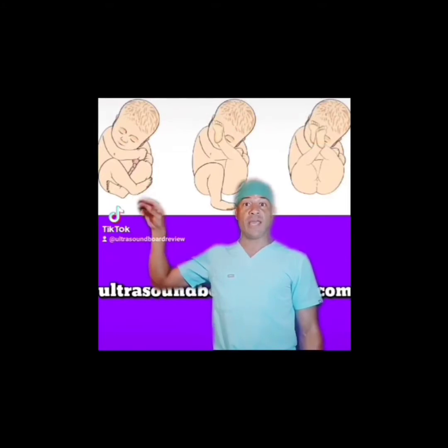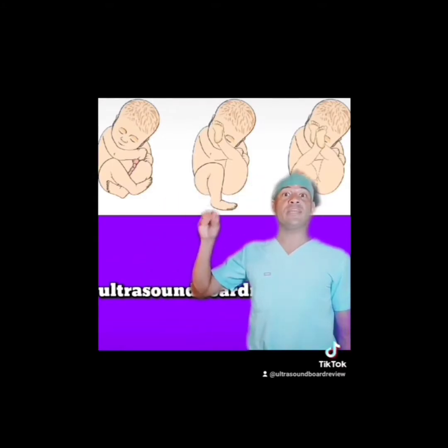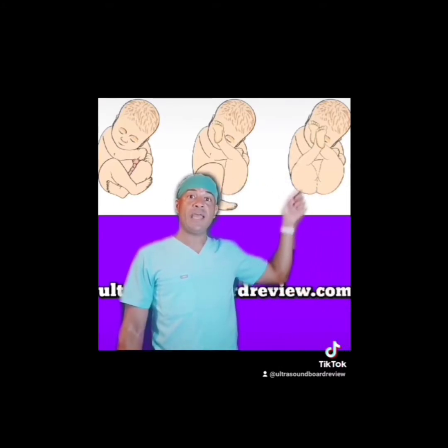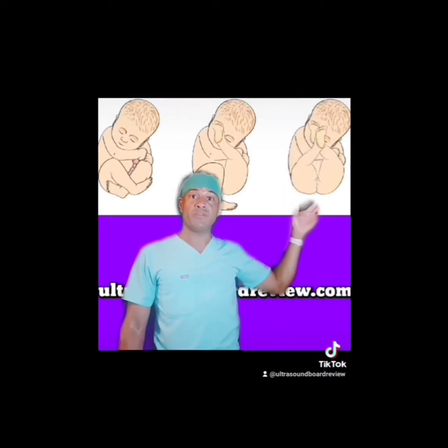This is where the fetal legs are crossed down by the fetal bottom. So the bottom will be delivered first. This type here is called a single footling, where one leg is directed inferiorly into the mother's pelvis. This right here is called the frank breech. This is where the fetal legs are bent at the hips and crossed up by the fetal head. So the fetal bottom will be delivered first.